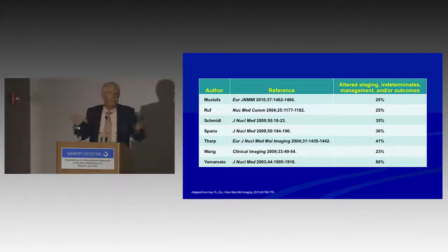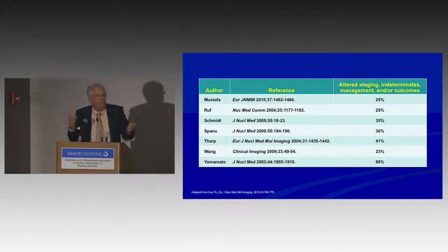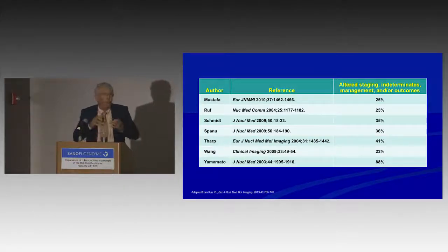Now, we all know a chest x-ray is a chest x-ray is a chest x-ray. Pretty much the same at every institution. And this audience of endocrinologists predominantly, although I know we have some nukes in here, obviously surgeons, but we all know ultrasound is an operator-dependent procedure. We often think when we come to a radioiodine scan, it's a chest x-ray, chest x-ray, chest x-ray. It's not. It's very operator-dependent. And I'd like to make that point and prove that to you.